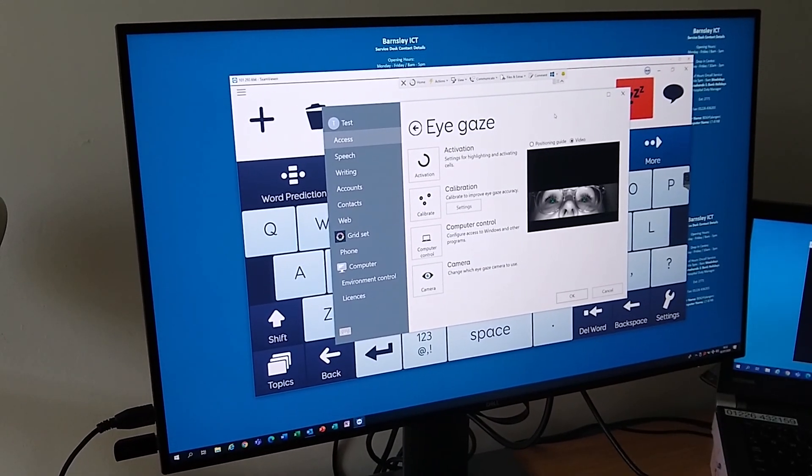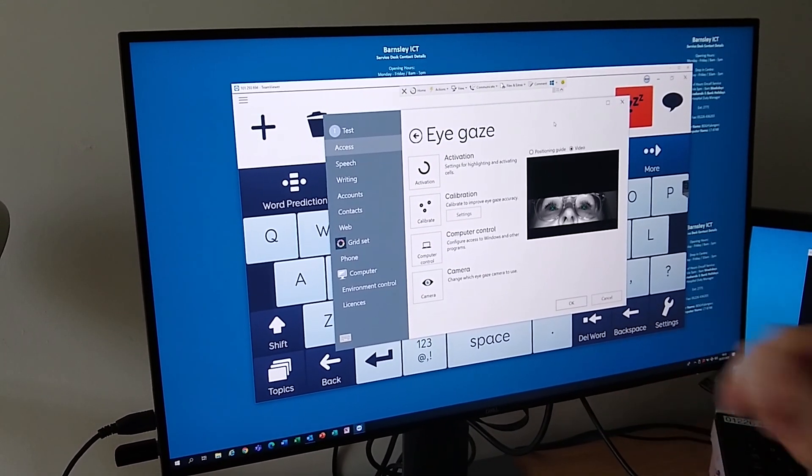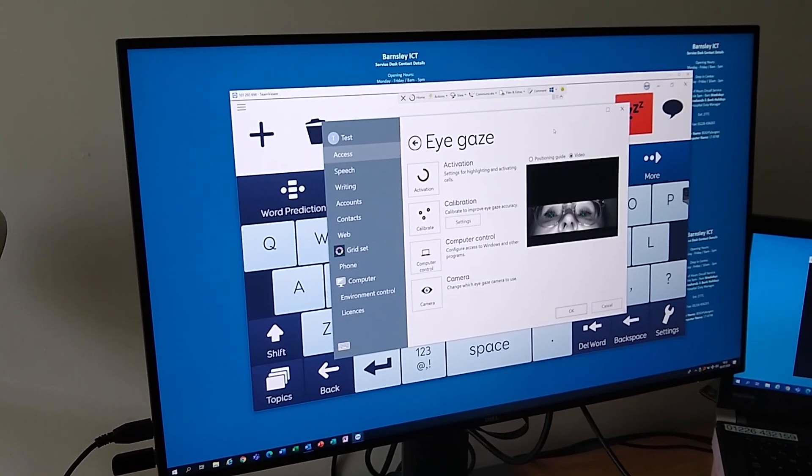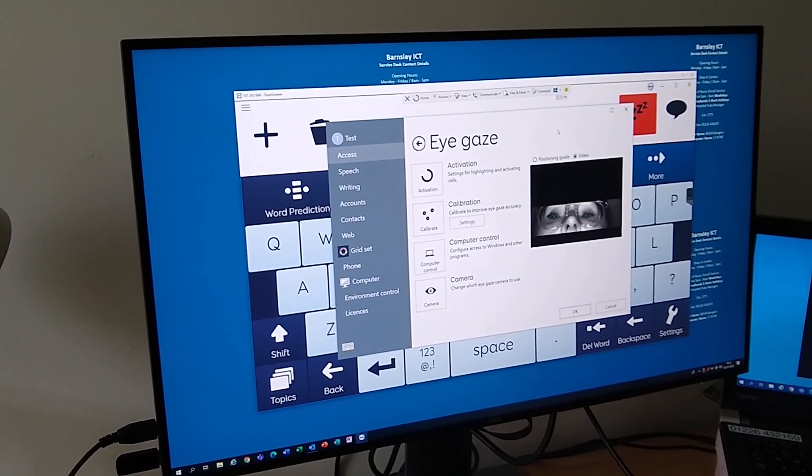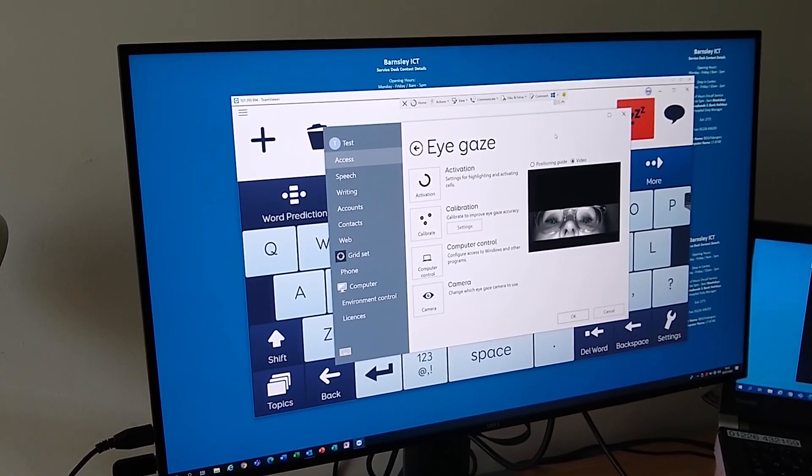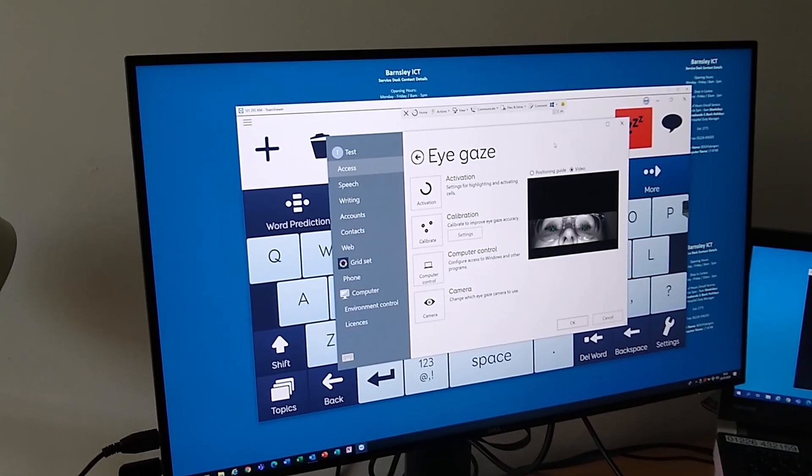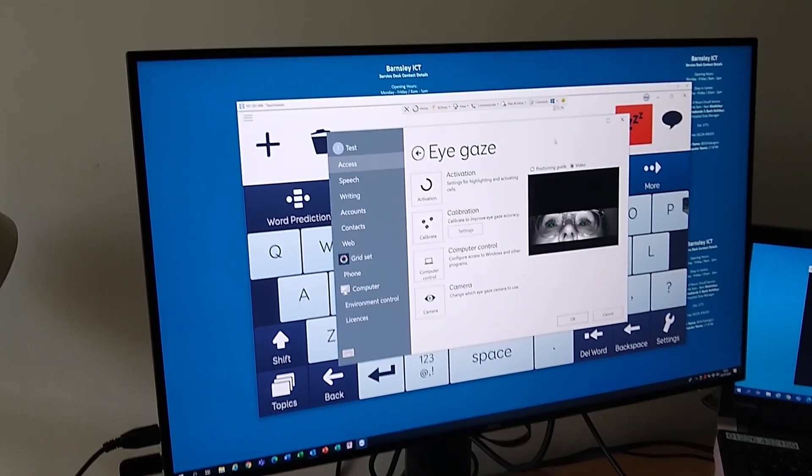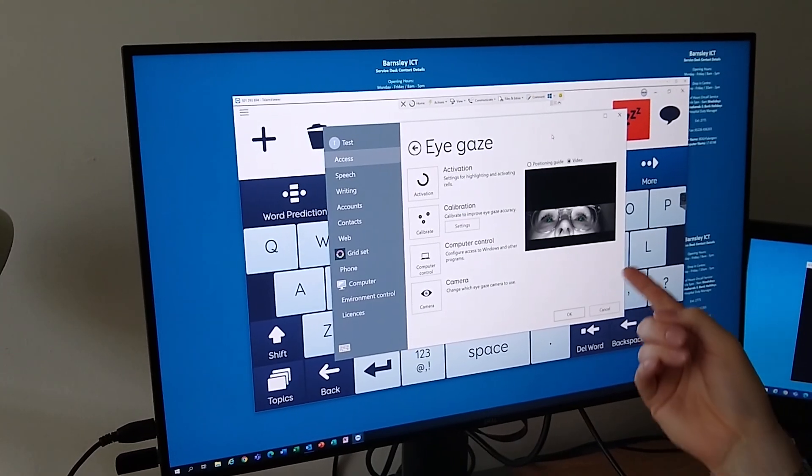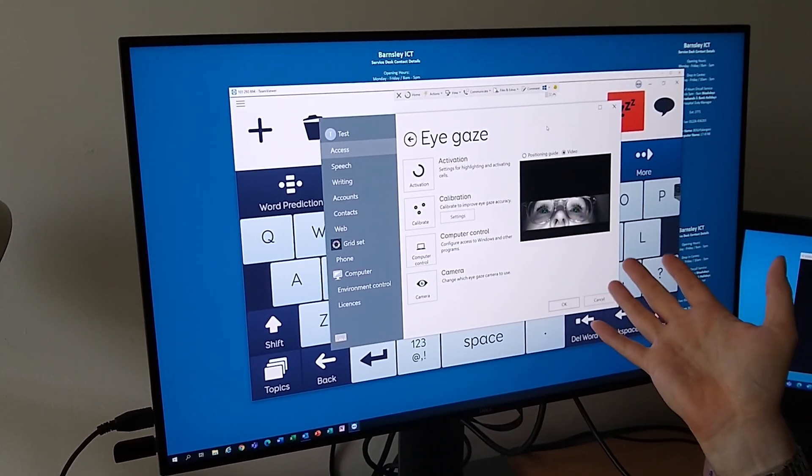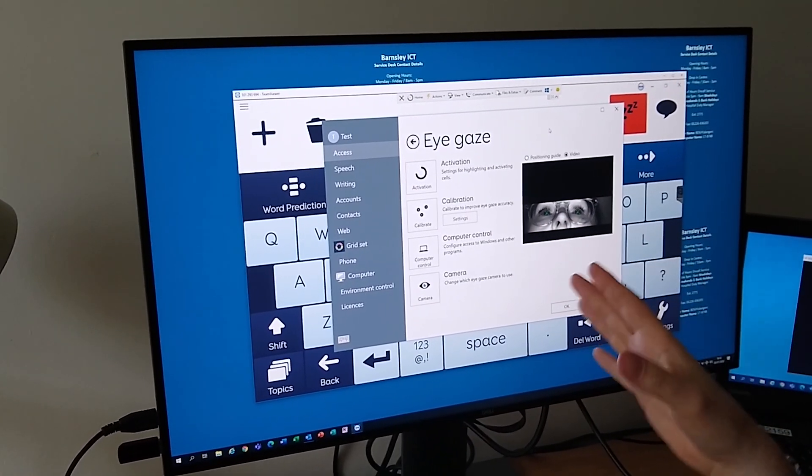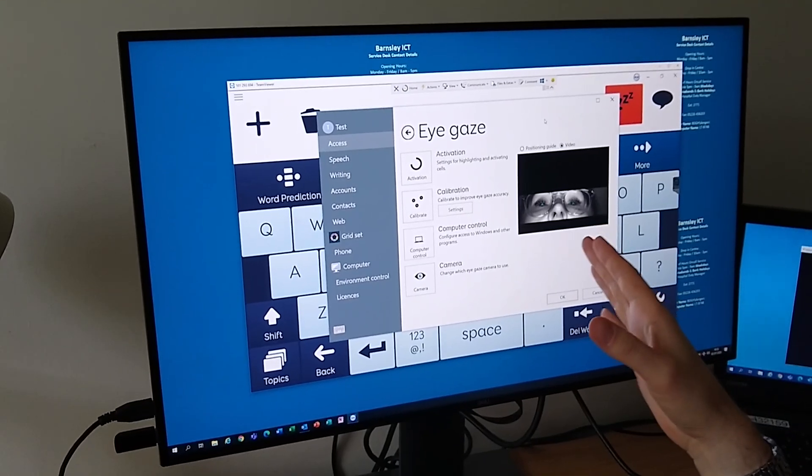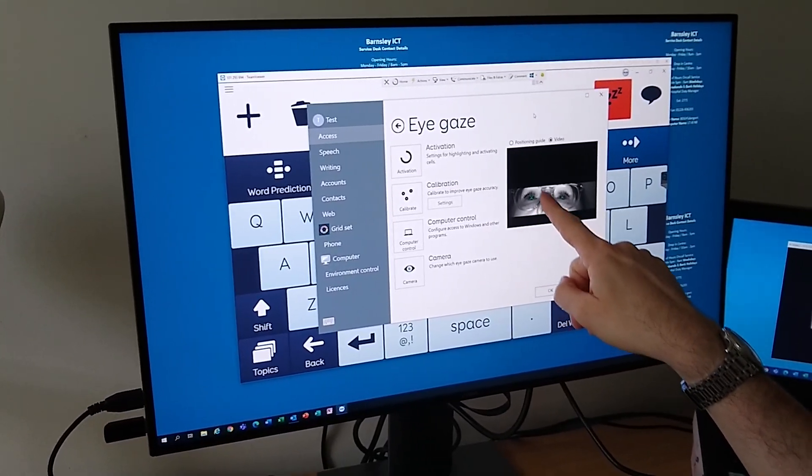The other thing I'm going to ask you to do, Alison, is have a look at the bottom left corner of the screen, the bottom right corner of the screen, the top left corner of the screen, and the top right corner of the screen. So that shows us here just how much eye movement is required to use this device, which is actually not that much. You'll see at all those points the pupil could be seen.